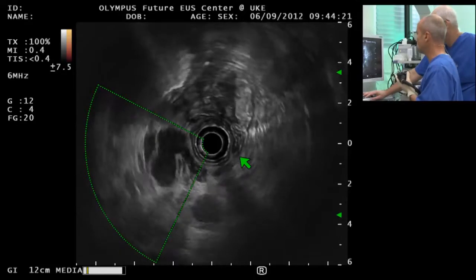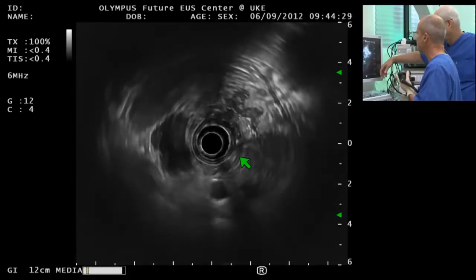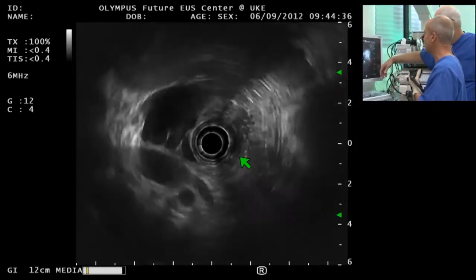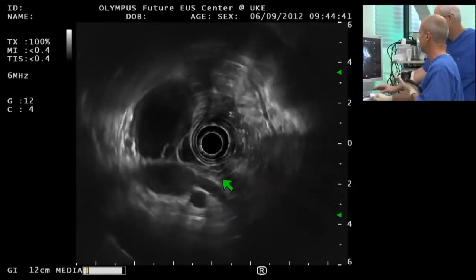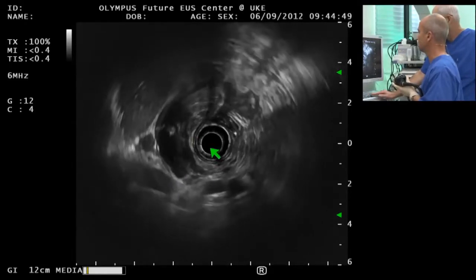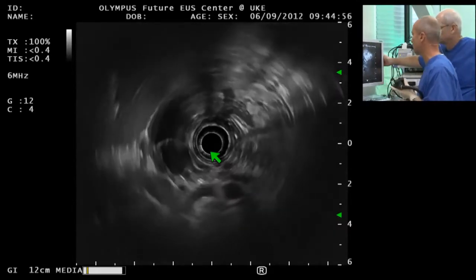And we talked about that with Rob before seeing it live, and it seems to us the most probable etiology. You see here, now progressively withdrawing the endoscope. I have no more. You see the pancreas, which is there, body of the pancreas. You have the usual aspect through the stomach, and you see that the cyst is really external to the pancreas. It's up on the level of the head. It is certainly close to the head, but not originating from the head.